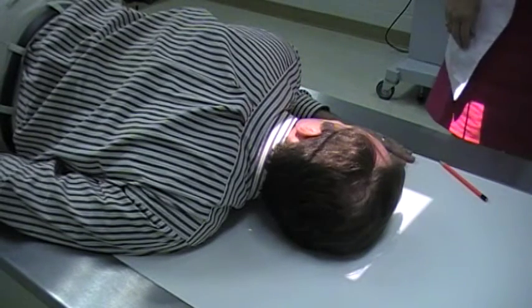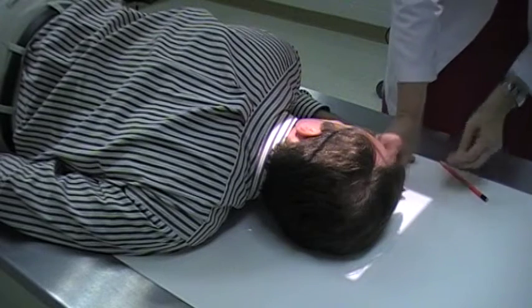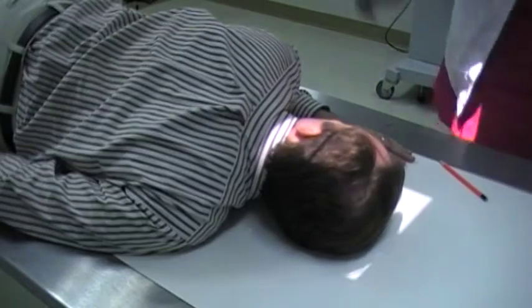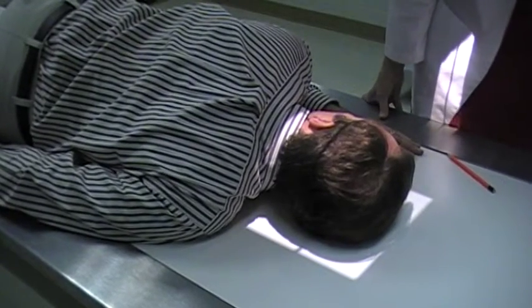So when we place our marker on, the right side is down, so we're going to mark it as right, and I like to put it right in front of the face. That way we know it will not be in the middle of the cranium when the exposure is, we check the exposure.